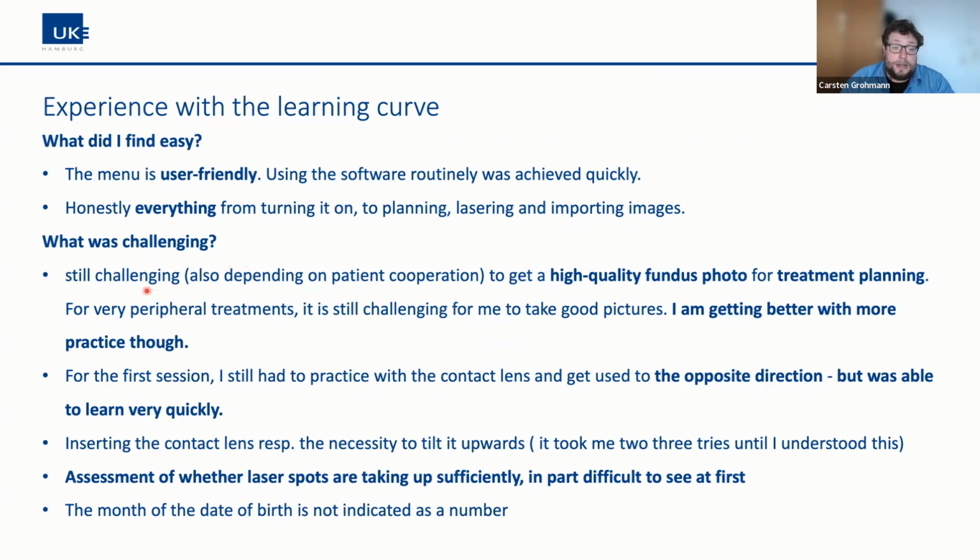What was challenging? Still also depending on patient cooperation, getting a high quality fundus photo. At the beginning it's demanding to get high quality fundus imaging, but after the treatment of the first 10 patients, each of our key users is fine with this, and the whole team now makes high quality fundus imaging for the treatment planning. It gets better with more practice, though. In the first session, practice with the contact lens.